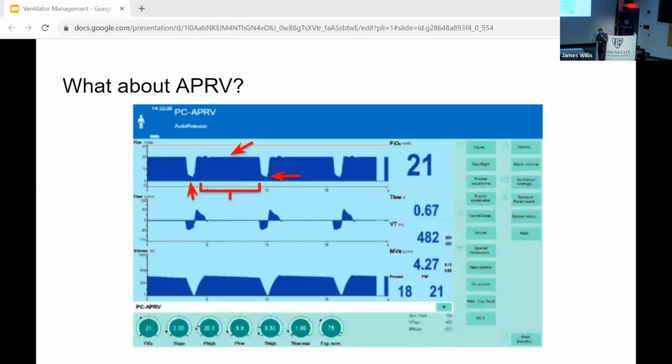And then there's people that are just diehard, I'm going to do APRV, and that's how I was trained. And I think it's about balancing all of those things, getting exposure to APRV while balancing it with the evidence and applying it on a case-by-case basis. If you think about APRV, it lets the patient spontaneously breathe because it's CPAP, just taking a few breaks like we discussed, but it's also subjecting the thorax to higher pressure for a longer period of time. So you have to make sure that the patient can tolerate it from a hemodynamic perspective.